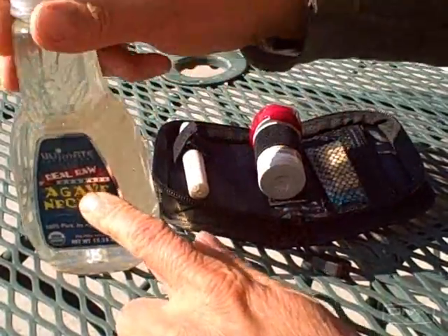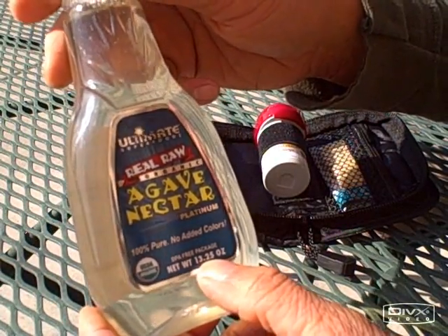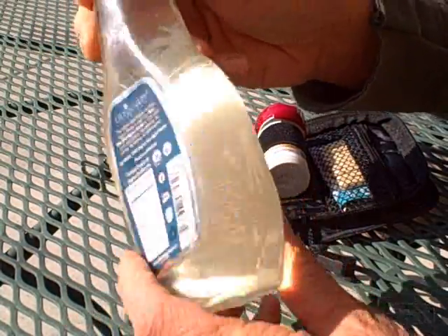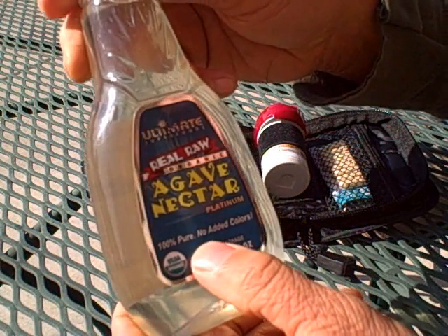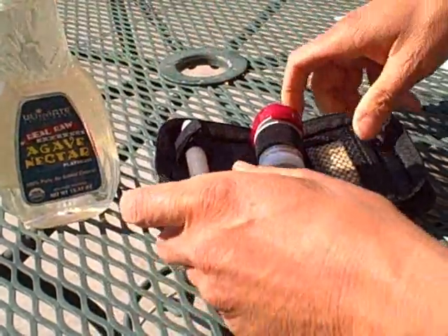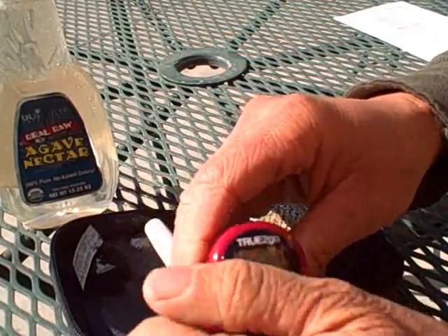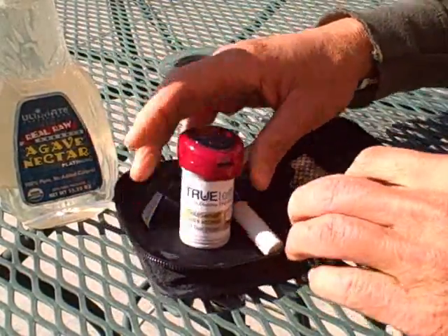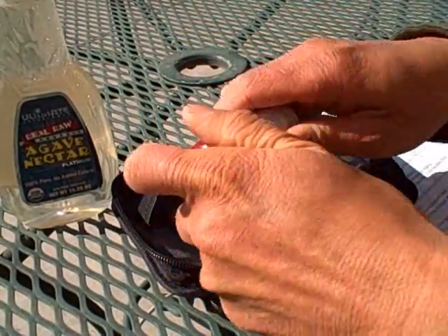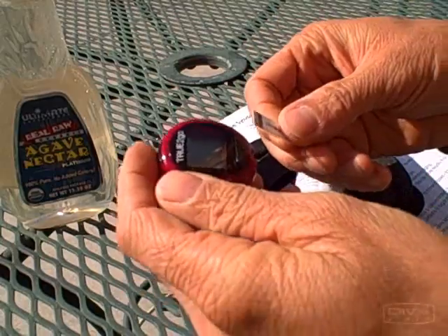We have the really raw organic agave nectar. This stuff, just 13.25 ounces, was $6.99 — that's really expensive. I got the really raw version because some people say the regular version is not actually raw. Now we're going to do my fasting blood sugar right now. I have a blood sugar test kit, or a blood sugar meter — they're really easy to get at any drug store, and it's common that diabetics use these. We'll go ahead and insert a test strip into the meter.